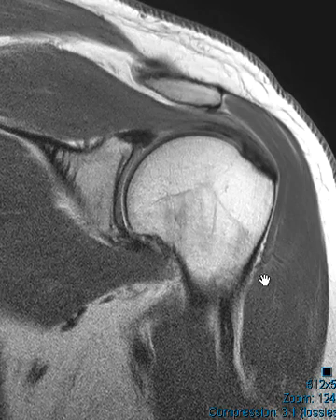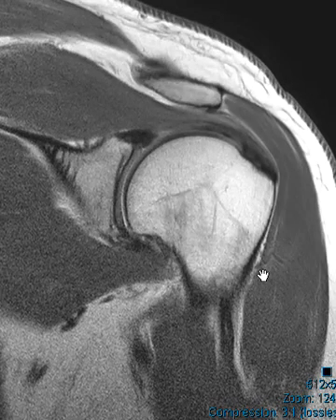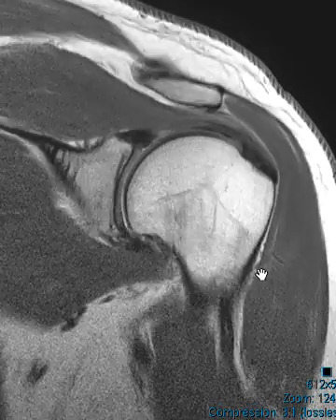Hello, this is Dr. Gay from FirstLake MRI, and this is a 57-year-old male with shoulder pain. They thought they may have a labral tear, so they did an MRI arthrogram. On this arthrogram, this is a PD sequence, non-fat sat.